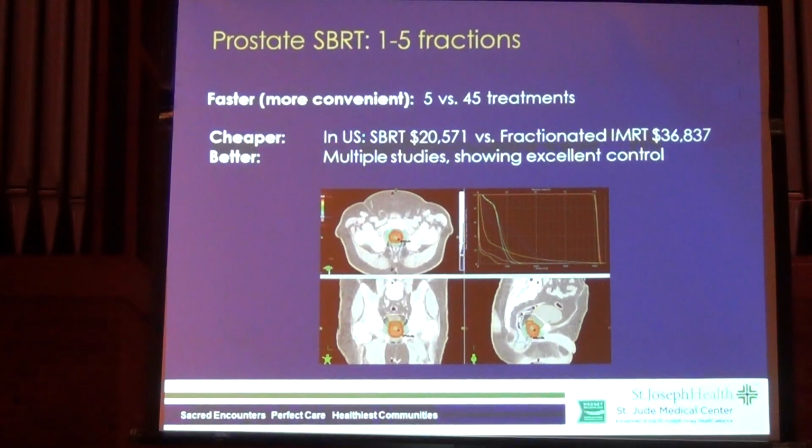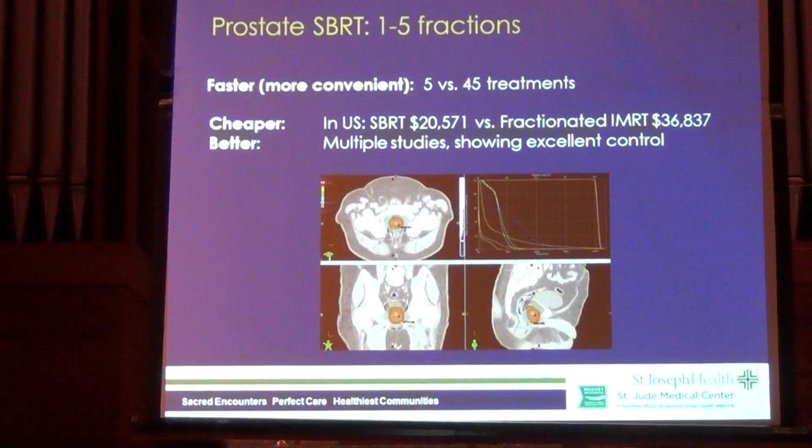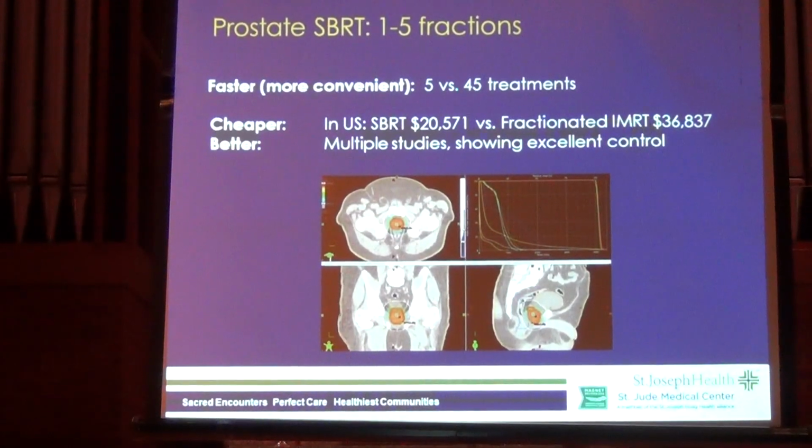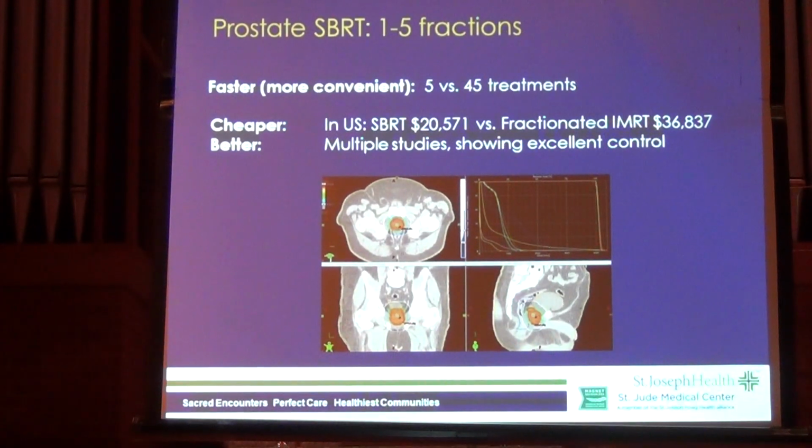So we already said it's faster. 5 treatments, 1 week, certainly fit. Can go over it ad nauseam. It's much quicker than 9 weeks, right? So it is also cheaper, and the cost is actually lower than what I'm showing here. Now it's more in the $15,000 range.